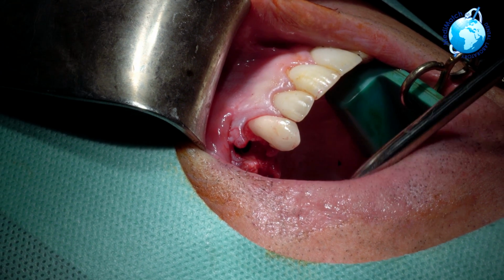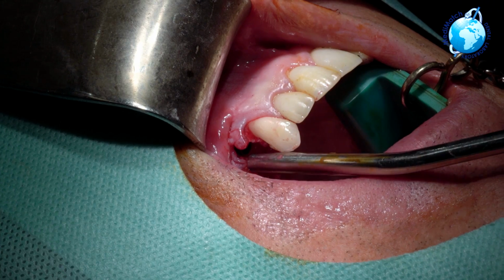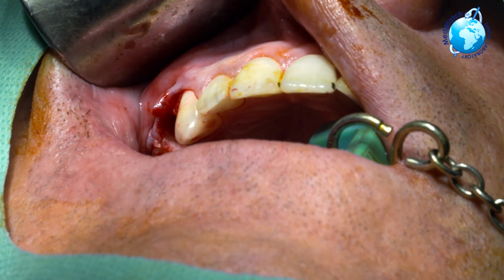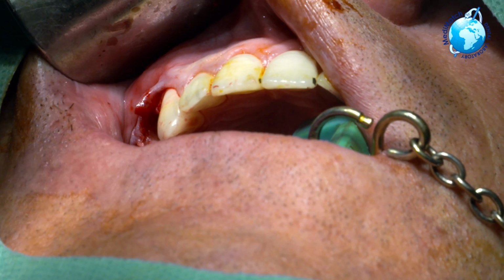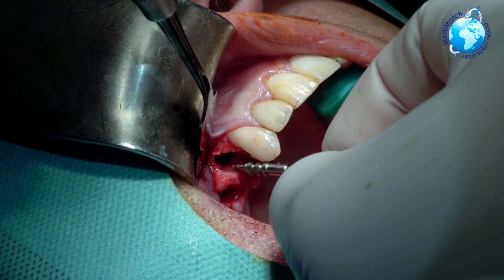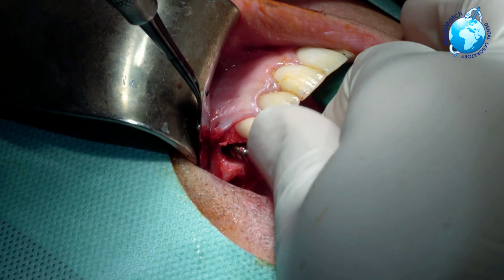So the clinical evidence shows us that any torque over 24 is acceptable for immediate loading. We are smoking at 47. Open for me, Alan. First implant's in, buddy. Are we all happy with that? Okay, I'm just going to put the directional indicator on.